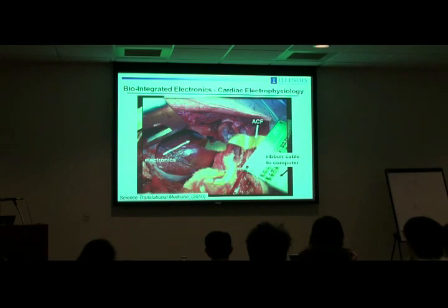So let me show you the operation of this device in what's called an epicardial mode. So this is an open heart procedure. This is a pig, it's not a human, so some of you may still be a little bit squeamish. I certainly am, although I watched this movie enough times to be sort of desensitized to it. But anyway, pig models turn out to be a good model for human hearts. About the same size for these Yorkshire pigs, which are about 90-pound animals.